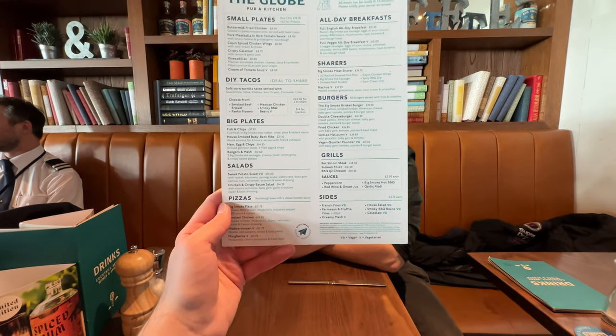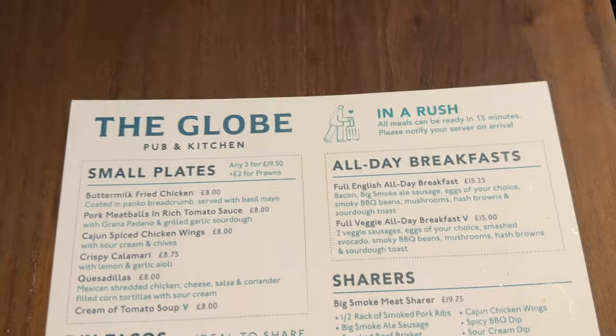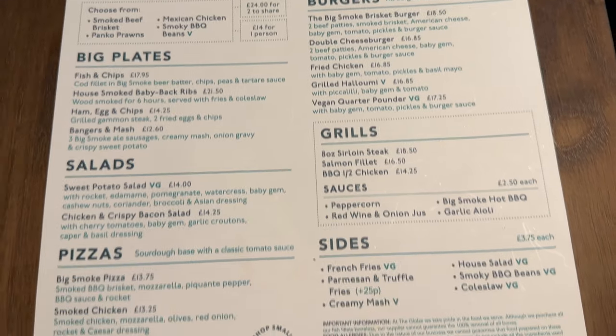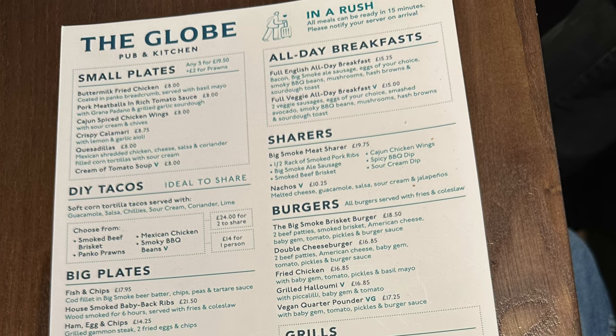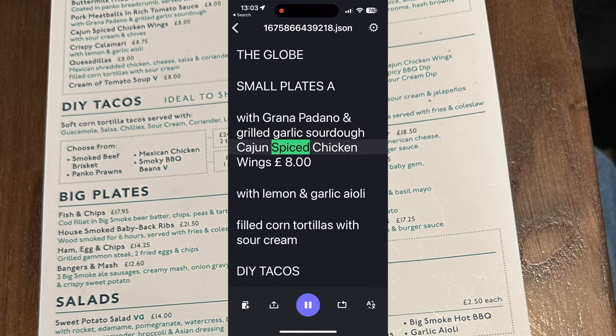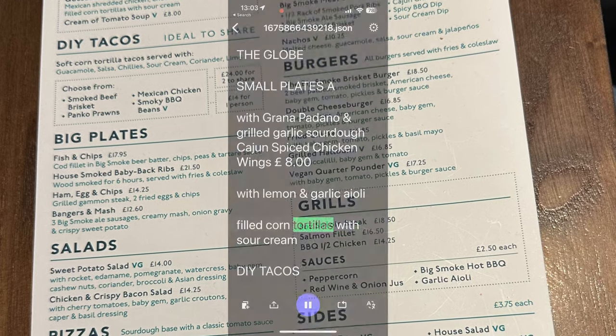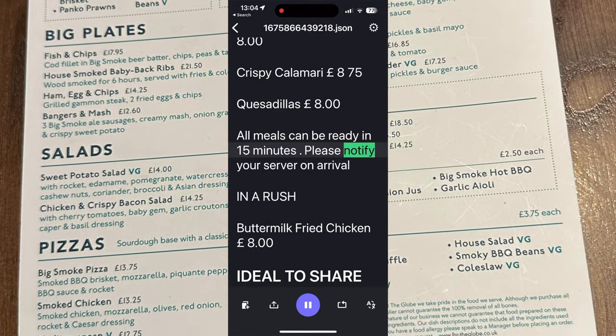It's also possible that you could use this feature in an education context, for example if you don't have any accessible reading materials. However, at Thomas Pocklington Trust, we always urge that this should be a last resort and accessible documents should always be preferred first. [Glasses prompting alignment]: Move document up or your head down. Move document down or your head up. [Menu read-out]: Small plates with Grana Padano and Grilled Garlic Sourdough. Cajun Spiced Chicken Wings £8 with Lemon and Garlic Aioli. Filled Corn Tortillas with Sour Cream. Crispy Calamari £8.75. Quesadillas £8. All meals can be ready in 15 minutes — please notify your server.